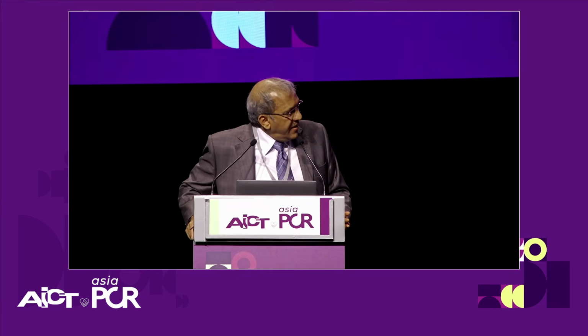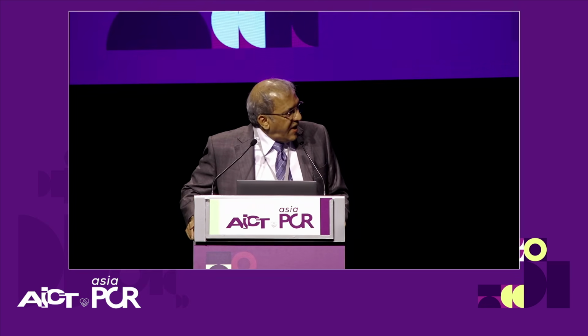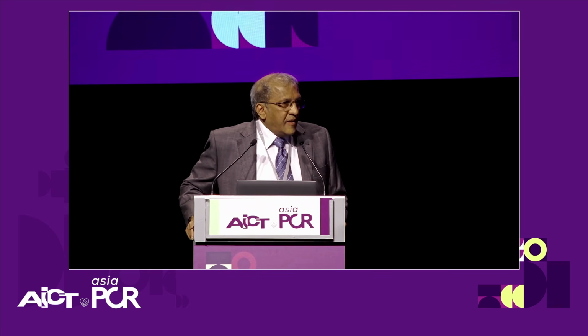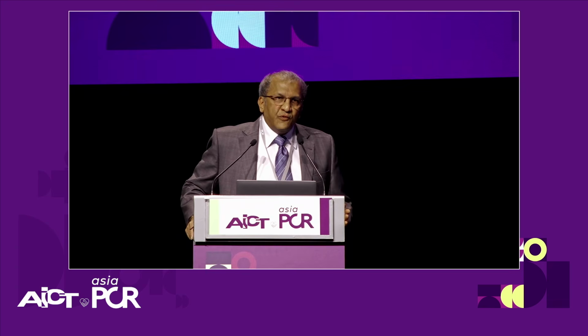I'd give as many pulses as I need to achieve expansion and then come out. I truly believe that you don't want to be in the coronary more than you need to be. That's one. But you need to give enough to have achieved why the IVL balloon has been put in there. And for me, that comes with being satisfied with the expansion that I see fluoroscopically. The problem in pulling back this balloon and trying to negotiate back is that it does lose profile, and you don't want to do that if you don't have to.